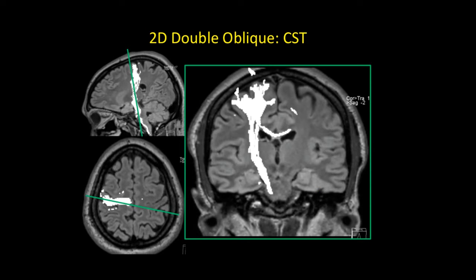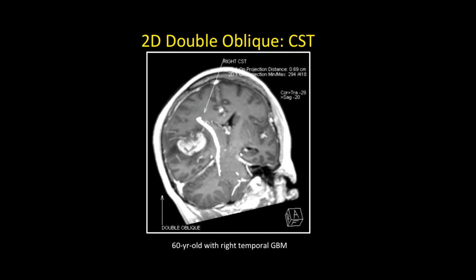Another post-processing step I do is to create double oblique snapshots of generated tracks to show them in the most complete profile with the lesion. In the MPR setting of your software, in this case Siemens Syngo and Leonardo-type software, you place the image slice along the long axis of the track in two different planes. Here is a double oblique coronal of the corticospinal tract and a tumor with measurements.